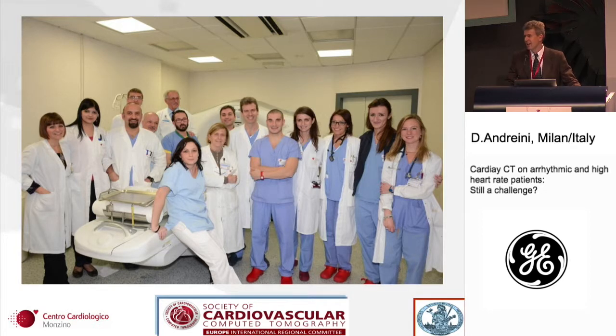And obviously I'm meaning stents, particularly small stents, but particularly calcium. So they are still challenging for the anatomy, but fortunately, and this is the topic of Gianluca's presentation, we have tools to overcome this limitation, going to the functionality of the lesion and not only to the anatomy.